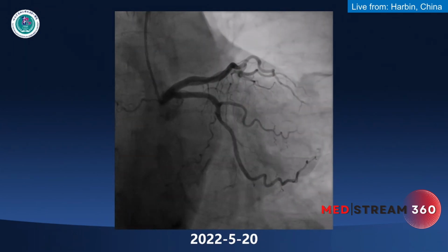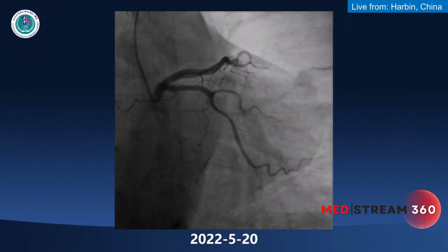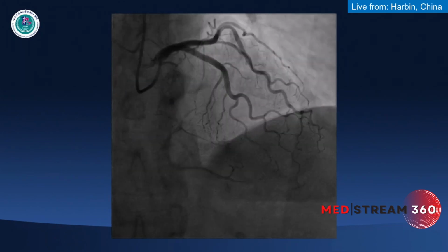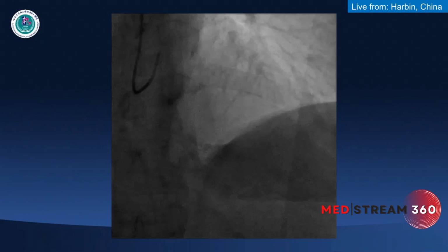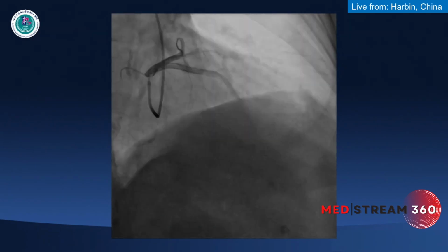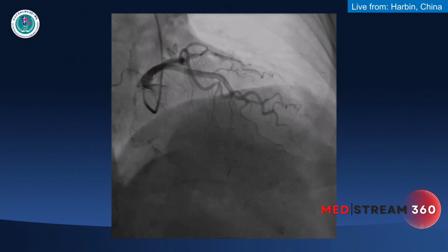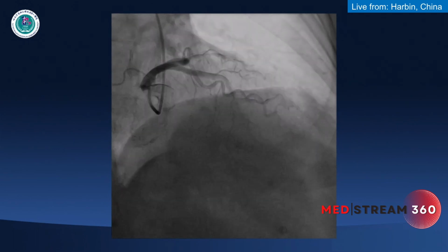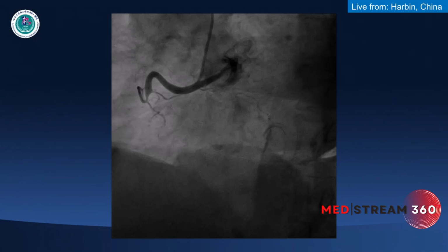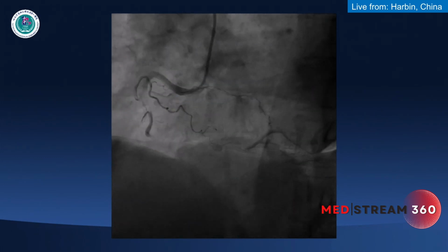And there is an atrial septal branch from the circ to the distal RCA, but very tortuous, couldn't be used. Next, and we can see the distal fibrotic cap should be just at the distal bifurcation side. This is a relatively difficult case. We can see several septal branches, but not very good. Next. So this is the RCA, total occlusion with septal branch, very tortuous.